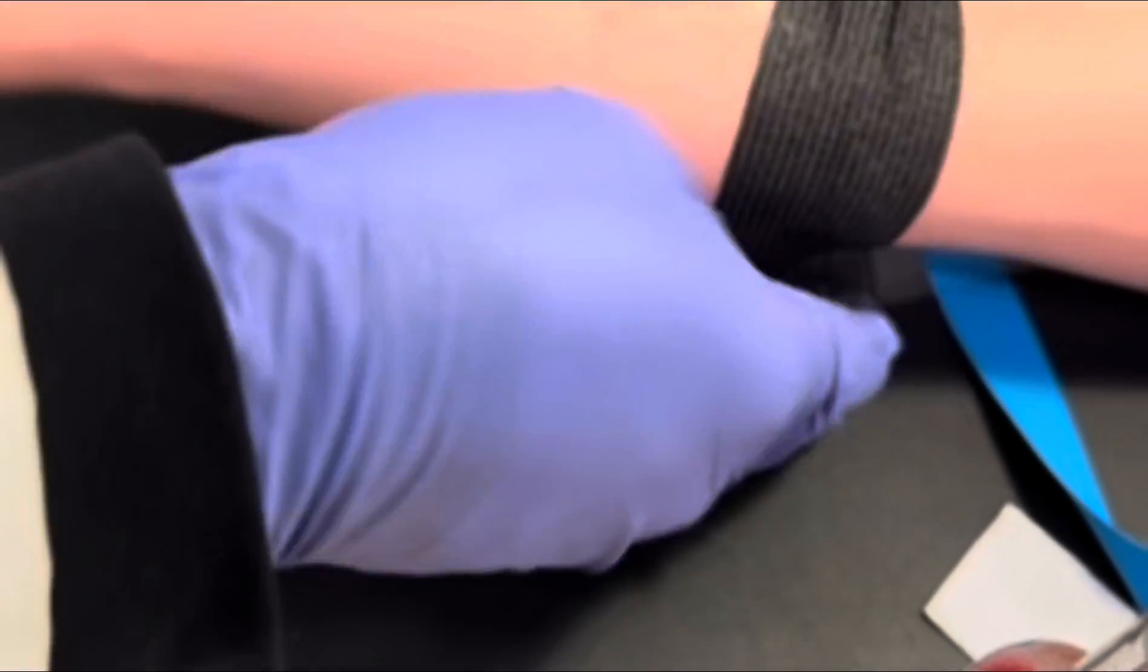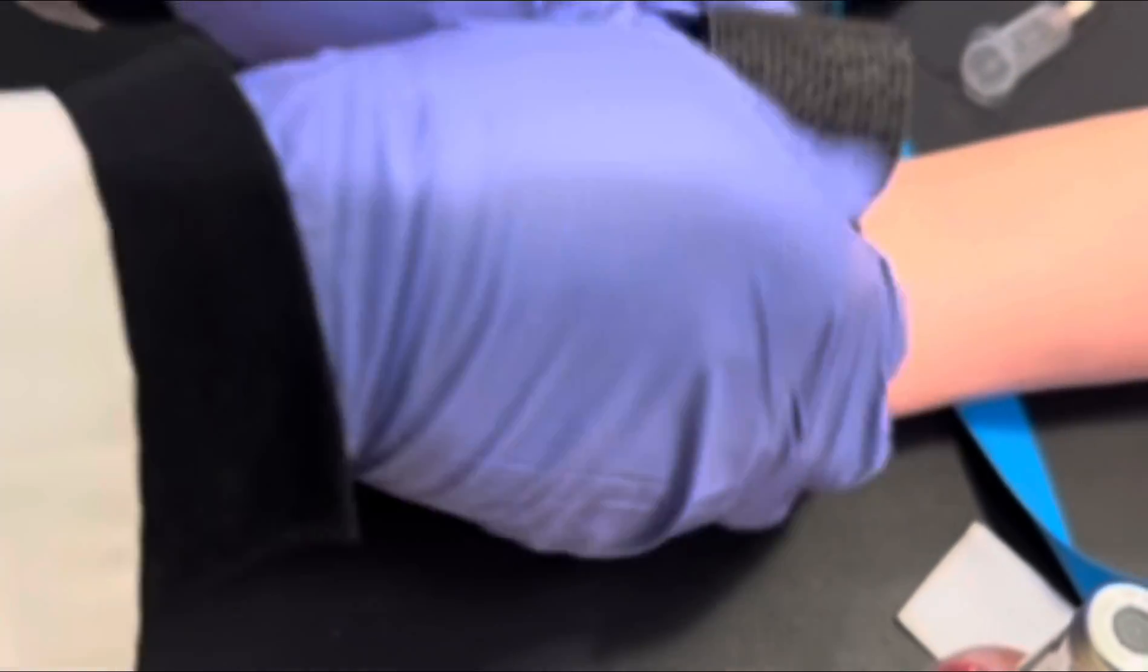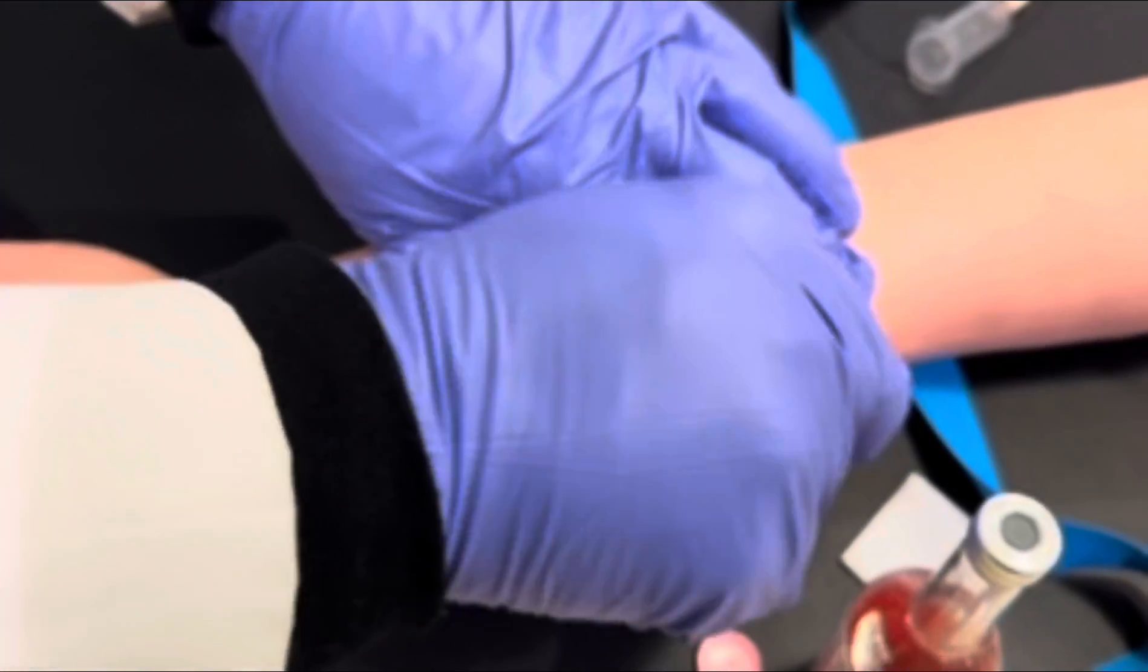And at this point in time, you can apply your CoFlex bandage to the venipuncture site to prepare for discharge of the patient.